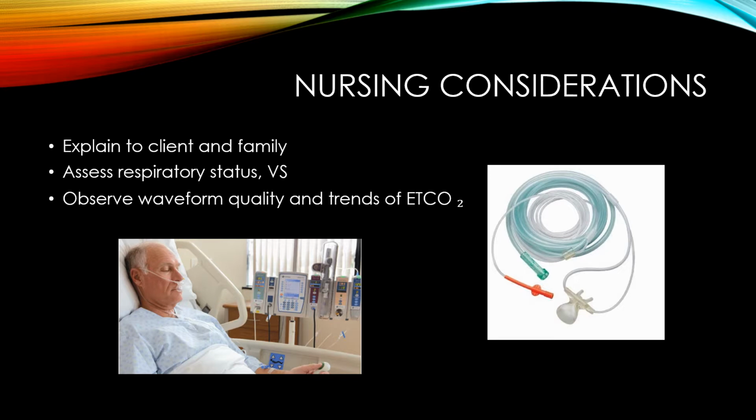Make sure you explain this to your client and the family. Especially for your client, if they just have the nasal cannula and end tidal CO2 device on, they just know there's this funny looking bulb that's getting in the way of them trying to drink, because it hangs down over their upper lip. So let them know the importance of this and why we are doing it.